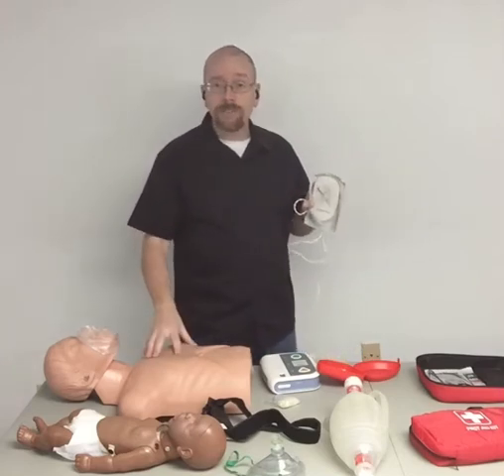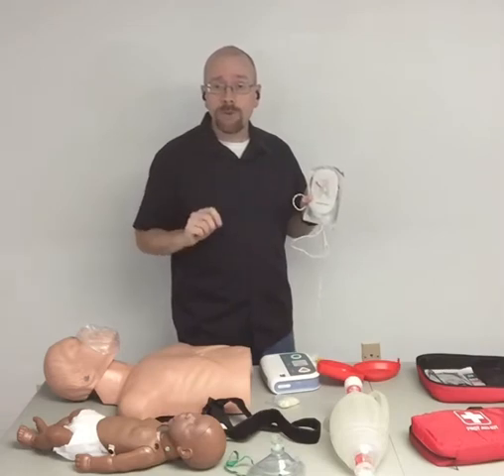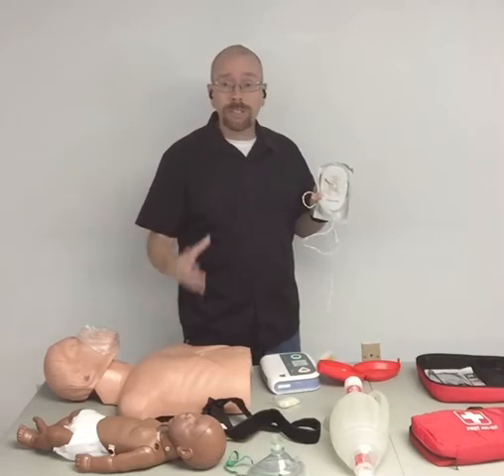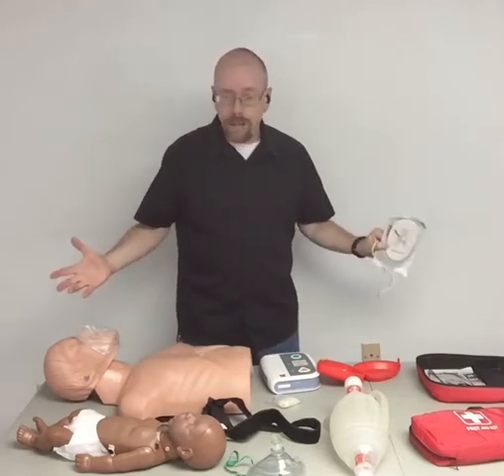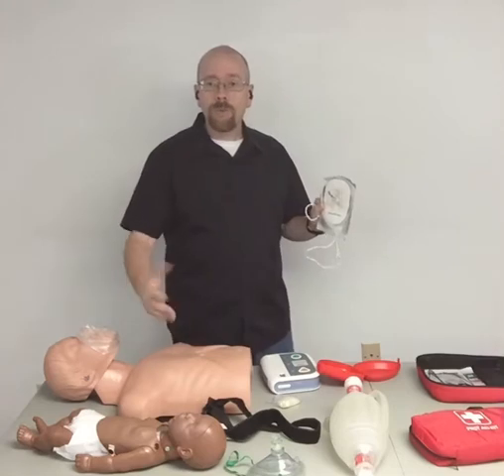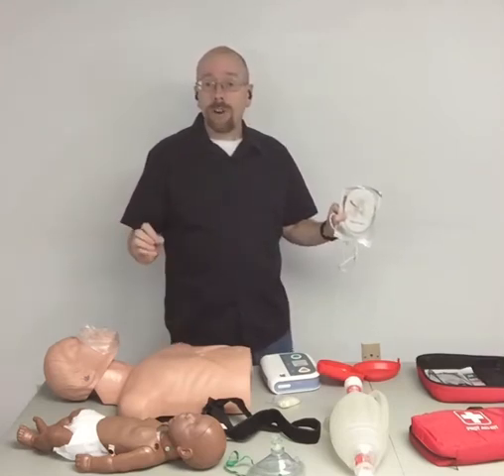Some people who have a history of heart disease may have a patch on their chest which says NG or nitro. That's nitroglycerin. That helps dilate the blood vessels so blood can flow better. But with an electric charge and the nitro, it is slightly explosive. You're not going to blow the person up, but you could cause a flare up on the chest, and we don't want that. So let's just try to get that nitro patch off the patient.